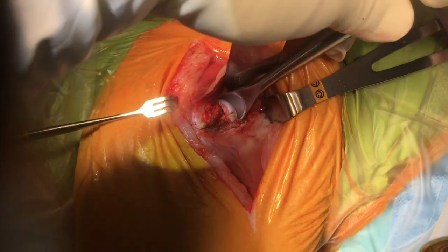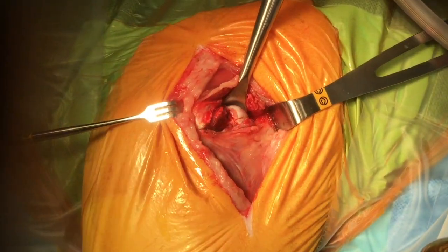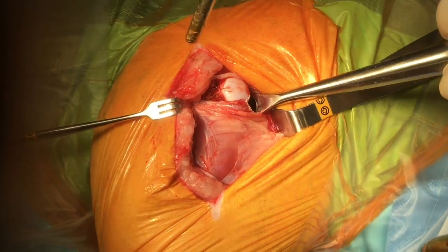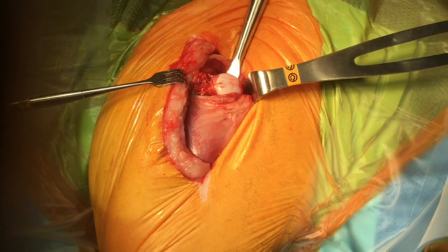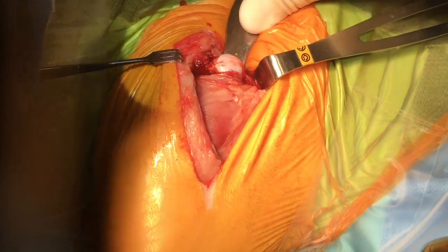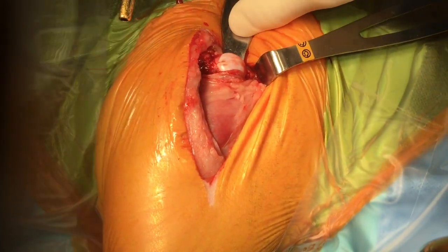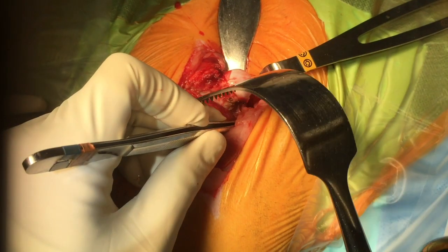In this severely dysplastic hip, no round ligament is present. External rotation of the limb will facilitate the luxation. This is the position at which the femoral head and neck resection will be performed.